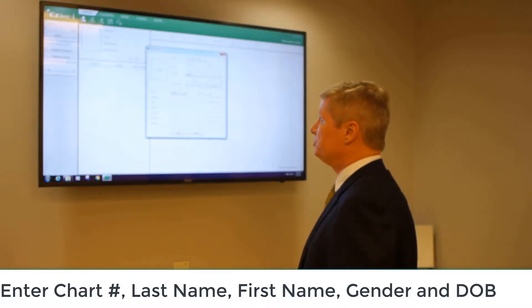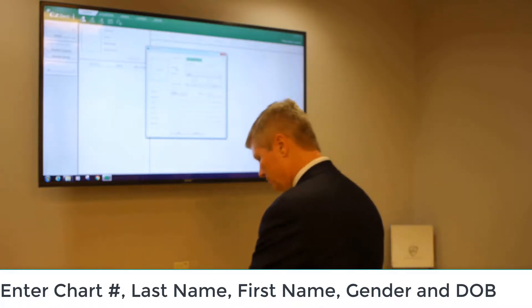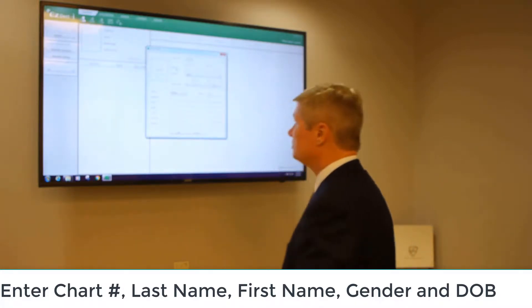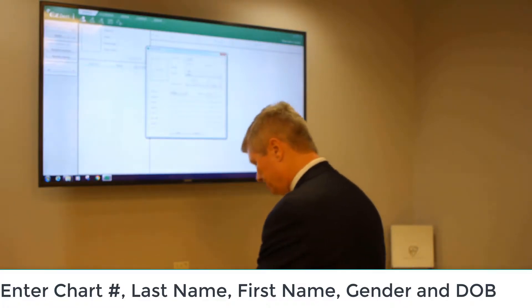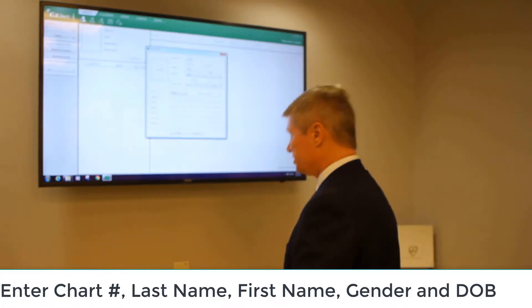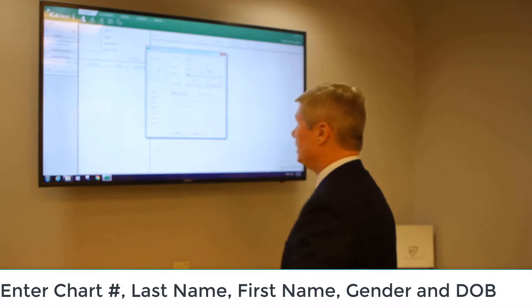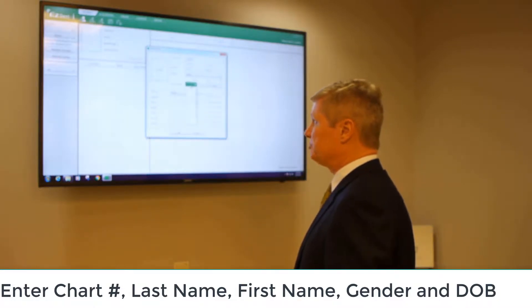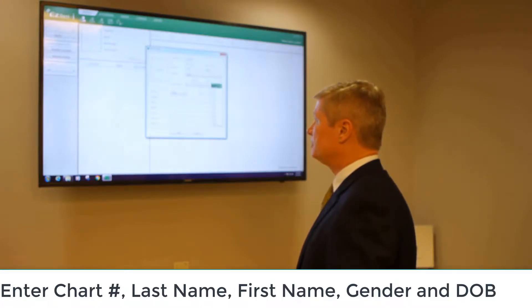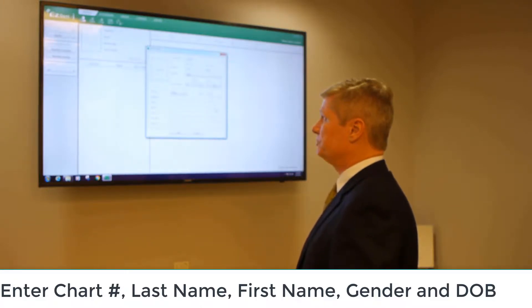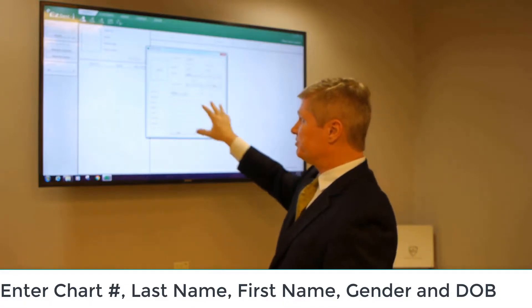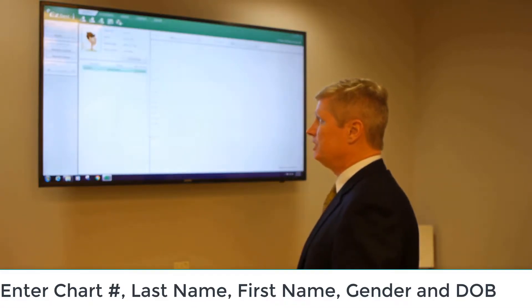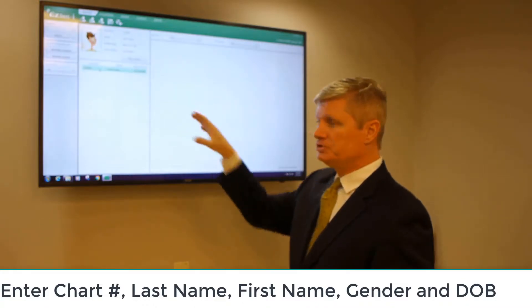From here, we can either use the automatically generated number or add in a custom number. Down below, we can put in the last name of our patient, click over for first name and enter that information as well. Then for gender, specify between male and female, and for date of birth, hit the drop-down for the month, drop-down for the date, and then drop-down again for the year. Once we verify this information is correct, click on Add at the bottom, and we've now added this patient to our database.